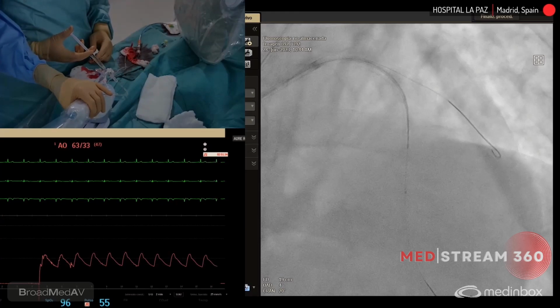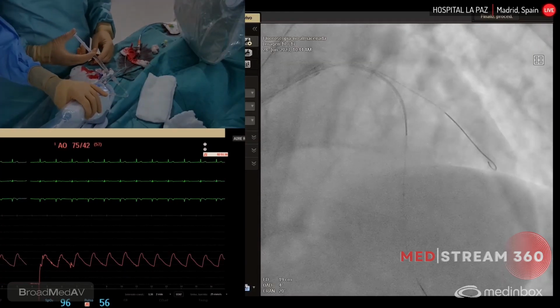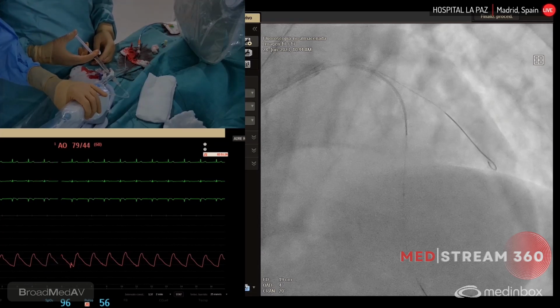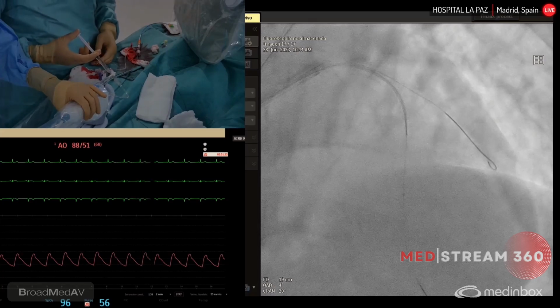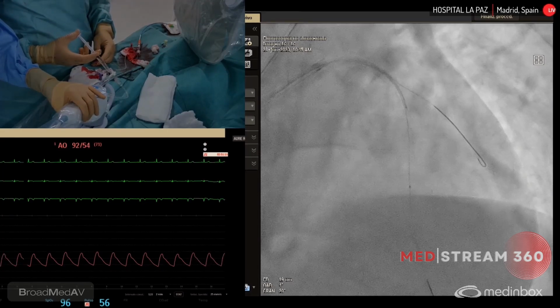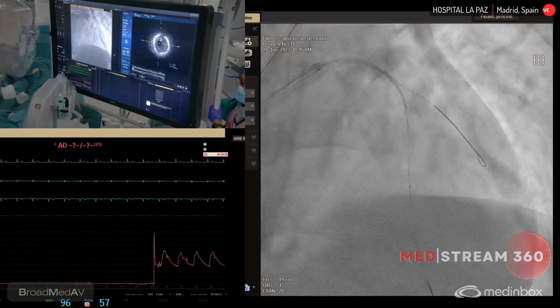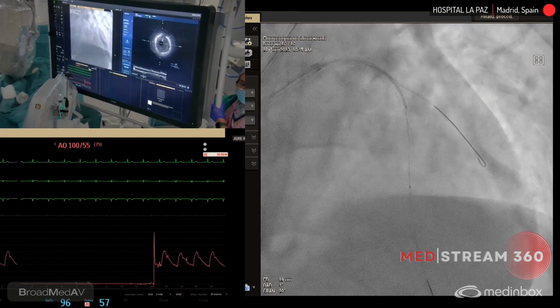Okay. Ese es nuestro stent ahora. This is the stent. The position is good, no? The position is quite good in the distal part. The expansion is also very, very good. This is the circ. The ostium of the circ is open. Yeah. And the proximal part is well opposed. Yes. Perfect. The POT is. Okay, stop. You can see now the IVUS, and Guillermo is going to analyze it outside.